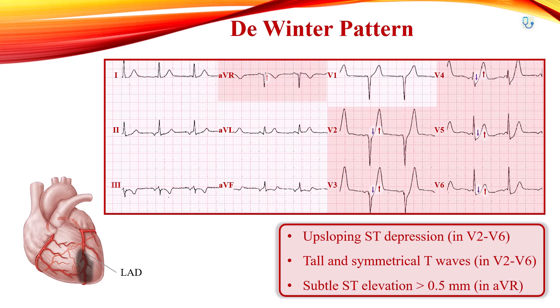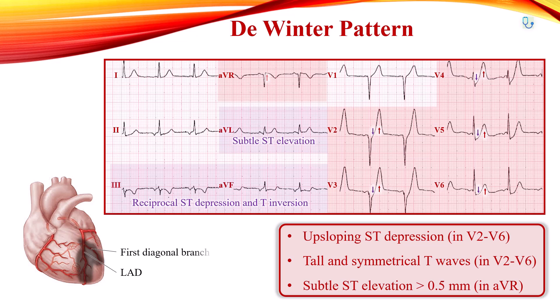In addition to the DeWinter pattern, subtle ST elevation in AVR and reciprocal change in leads 3 and AVF suggests high lateral involvement. This is consistent with left anterior descending artery occlusion that occurs proximal to the first diagonal branch.